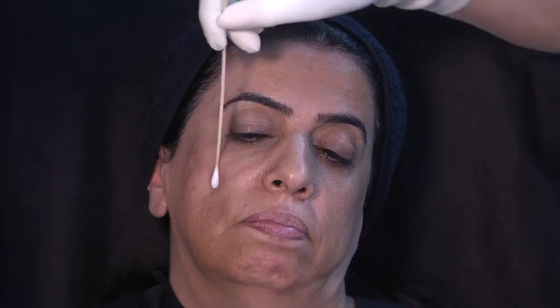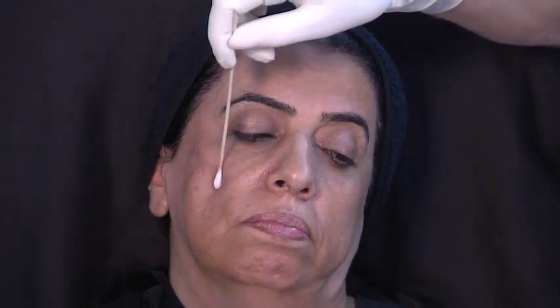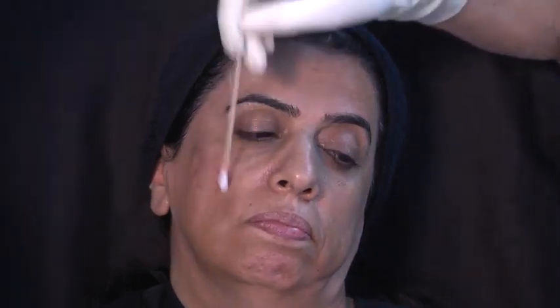So the zygoma is again our target, and what we're trying to do is define. So we're going to have some point of volumization probably around there. If we go, you're doing the 3 points? Yeah, he was doing the points, yes. Okay.